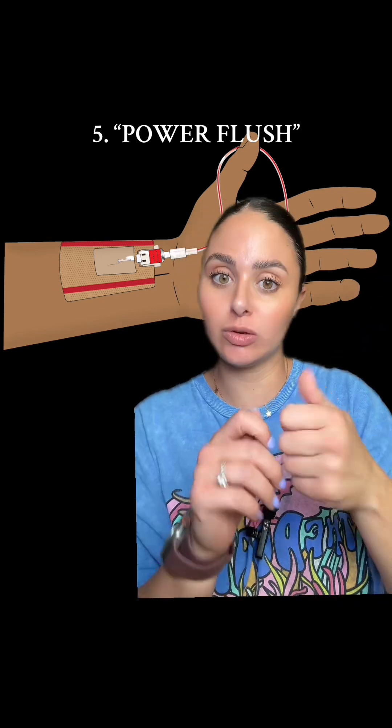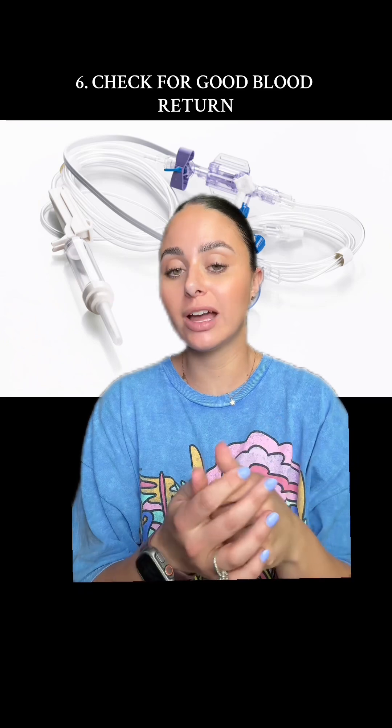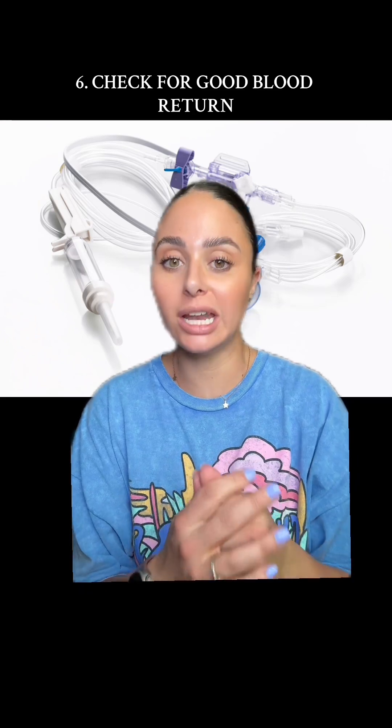Check all the connections, make sure nothing's loose, and perform a fast flush with the pigtail. You can flush the line or use a little saline syringe if you don't have the vamp system. You should be able to get some blood flow back by gently putting a syringe on there or using your vamp system — if you're meeting a lot of resistance, don't force it. If everything checks out — you're leveled, zeroed, no kinks, no bubbles, everything is secure, you can pull back and flush, and your pressure bag is good — move on to the next step.